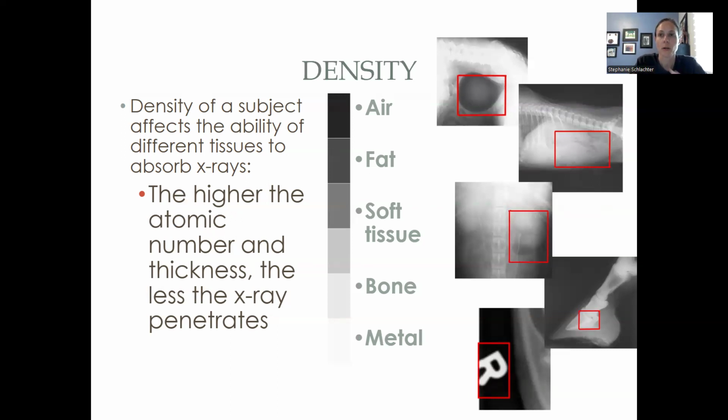Okay, so remember, overall density is overall darkness and lightness. An image that is more dense is darker, an image that is less dense is lighter. An object that is more dense, so what we are radiographing is more dense, is white. Something that we are radiographing that is less dense is dark. Okay, so again, a little bit of opposite land, but if you break it down and you think about it, it's easier to go through it, okay?